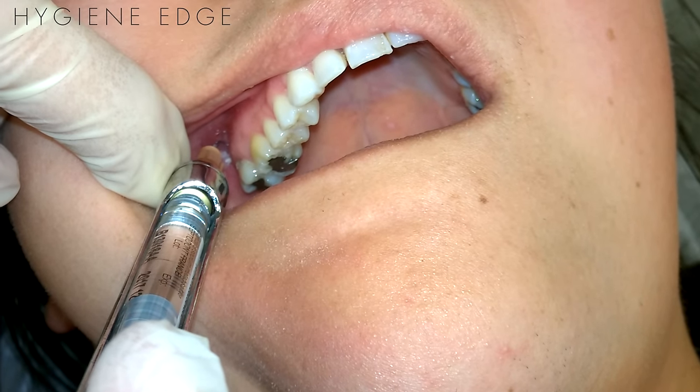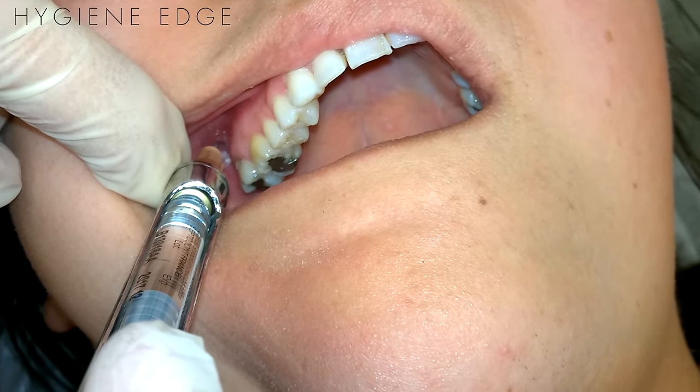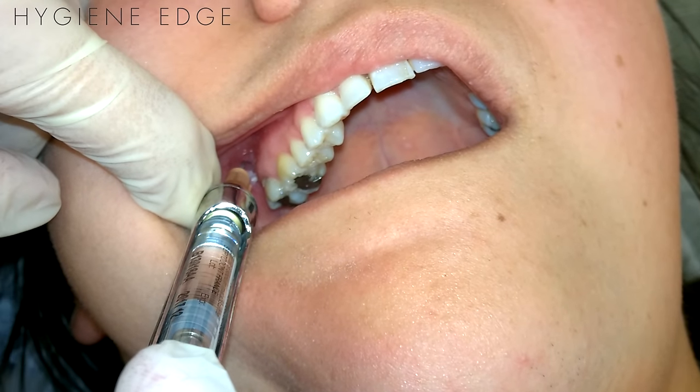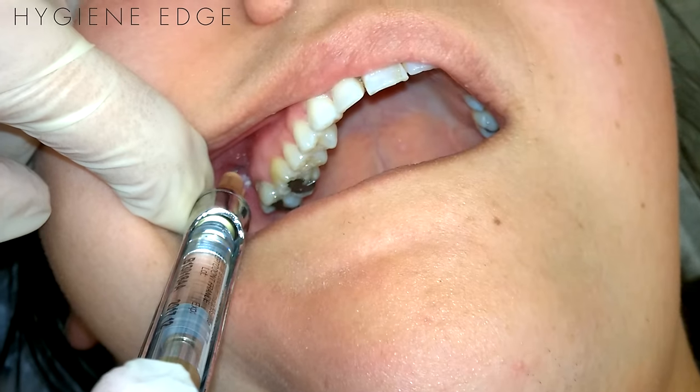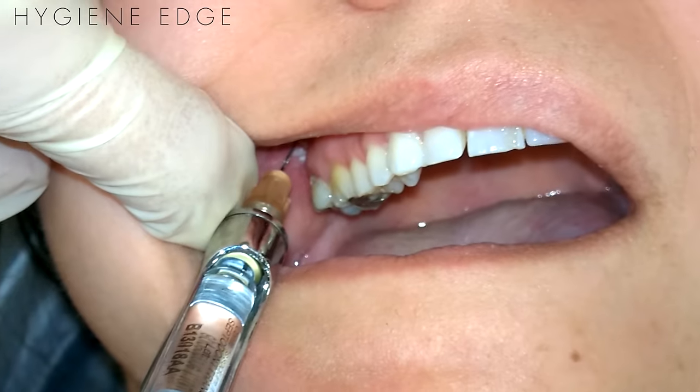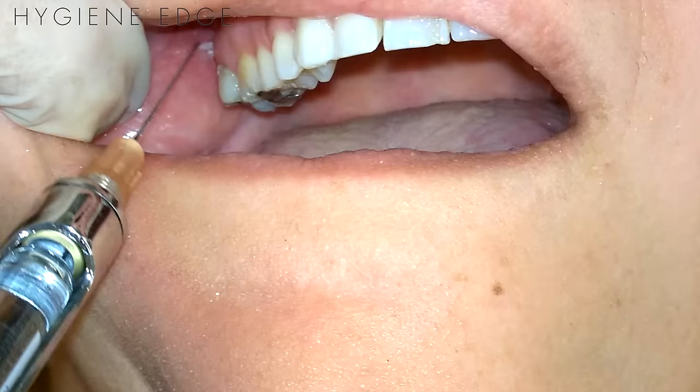This injection does have a high risk for hematoma, as you will be closer with a long needle to the plexus. Reasons to use this technique are if the patient is not getting numb with the usual MSA, PSA, or ASA for root debridement, or if you have a patient with lots of dental anxiety — this way you can do one injection versus three.